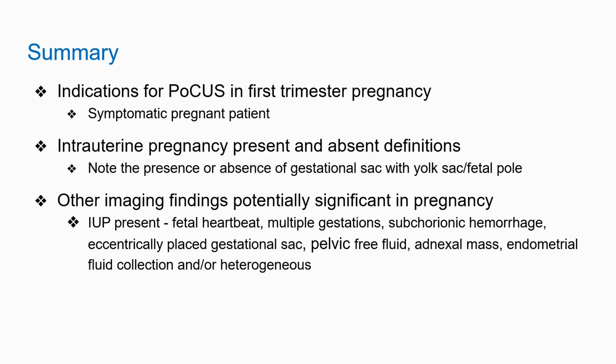This is where we summarize what we hoped that you learned from this tutorial, which includes indications for POCUS in the first trimester pregnancy, intrauterine pregnancy, definitions of present or absent, and other imaging findings potentially significant in pregnancy.